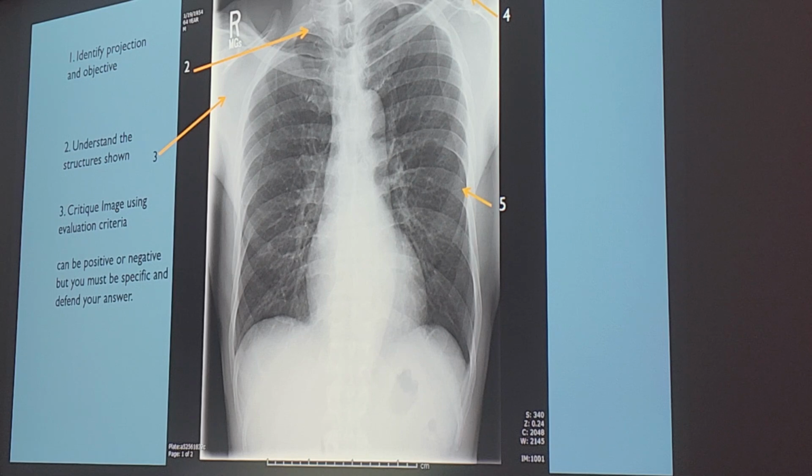Okay, so now that we've identified some of the structures, yes, Jay? To go back to the last point that we made, could we also use the gastric bubble to see whether it's an AP or a PA? You can, but on very few patients, remember their anatomy could be flipped. That is a good thing, but I wouldn't rely completely on that. That would work the same way with the heart shadow, too. Yes, some patients do have, what's it called? Contra something, when the anatomy is flipped.